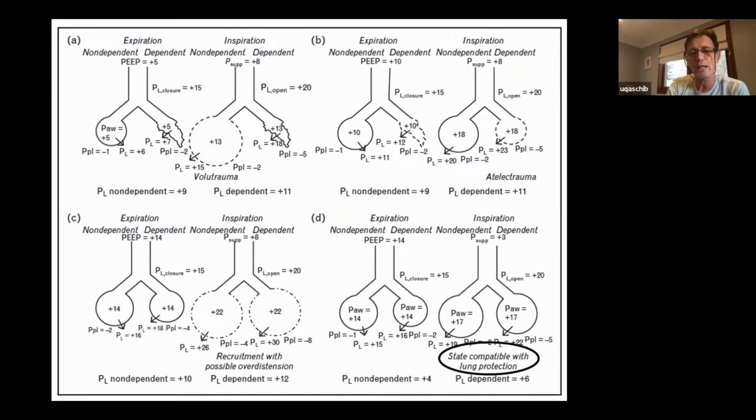And you can appreciate now that the bulk gas flow that occurs during these different scenarios is such that bulk flow is mostly occurring into the lung that experiences tidal recruitment. So volume change is mostly happening in these areas that are injured.